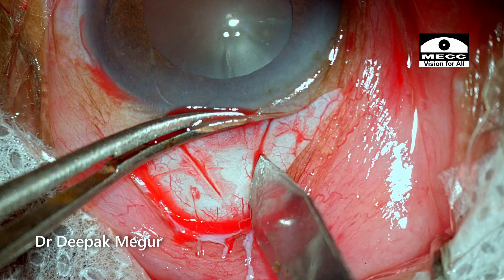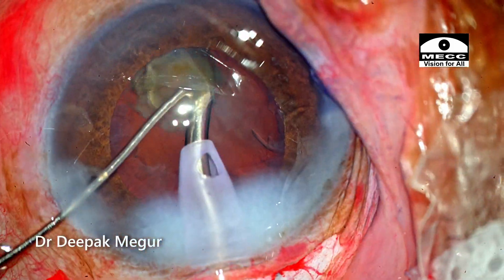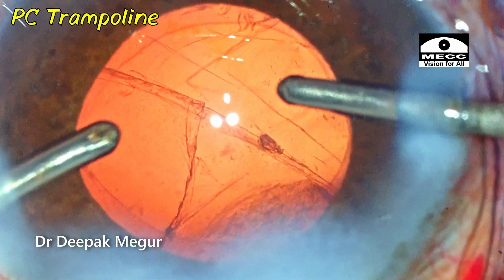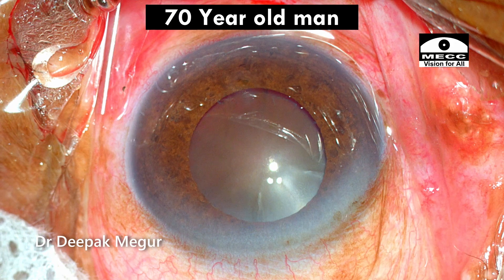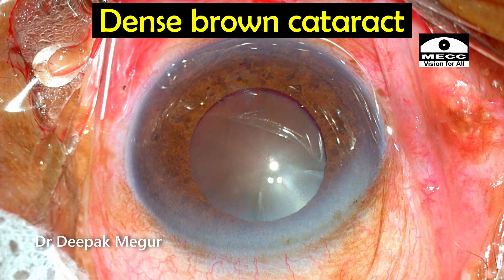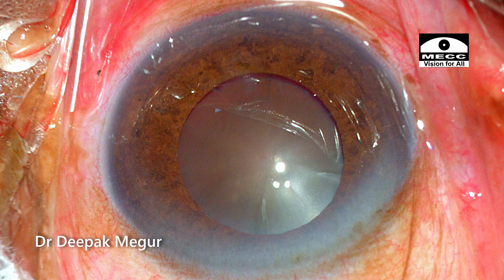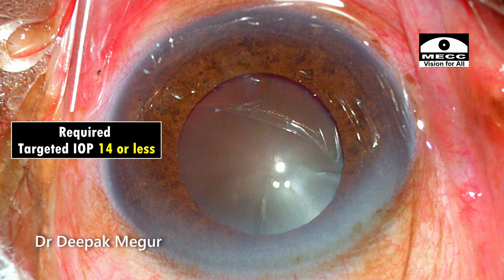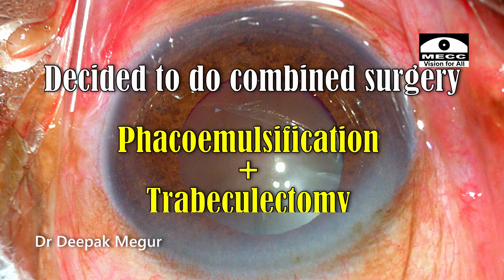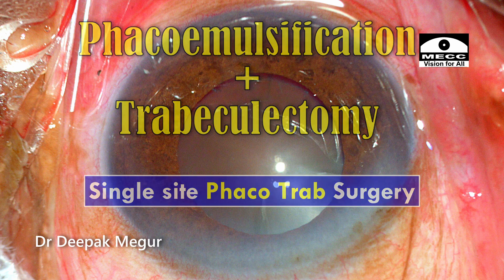In this case, apart from showing the combined surgery of phaco-trabeculectomy, I wanted to highlight the appearance of posterior capsule folds or posterior capsule trampolining. The patient is an elderly man with pseudo-exfoliative glaucoma, a dense brown cataract, and advanced glaucoma. He required a targeted intraocular pressure of about 14 or less, so we decided to do a combined surgery. I'll be performing a single-site phaco-trab surgery in this patient.